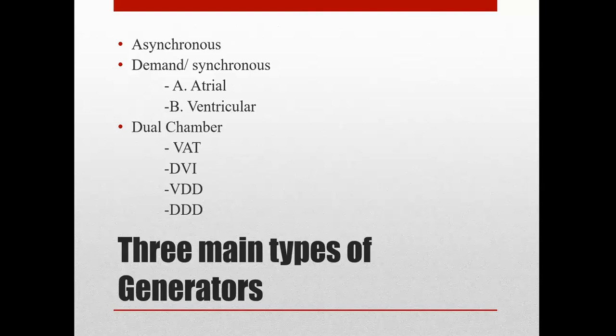So these letters are pacemaker codes that we'll talk about here in a little bit when we look at what types of pacemakers they are and try to decipher what's doing what.